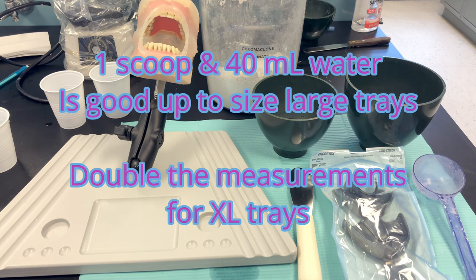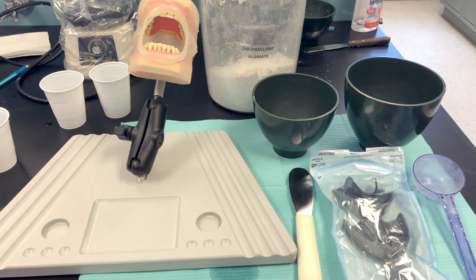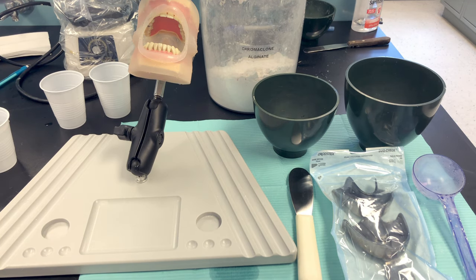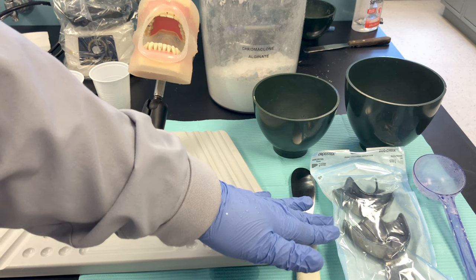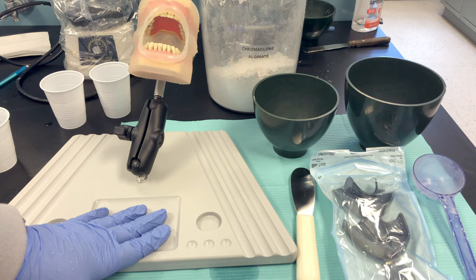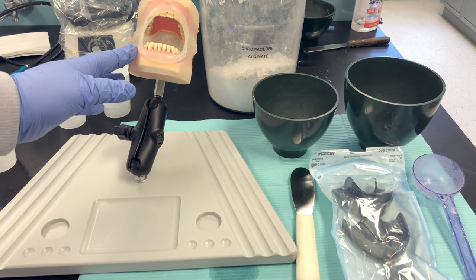Explain the procedure to your patient and let them know what to expect, even if they've had impressions before. Tell them specifically what you're using. You can say: I'll be trying in these empty trays to make sure we get a good fitting tray. Once ready for the material, it will smell like bubble gum, won't have much taste, and might feel cold. It will have a thick consistency — like putty, like thick mashed potato or thick pudding.